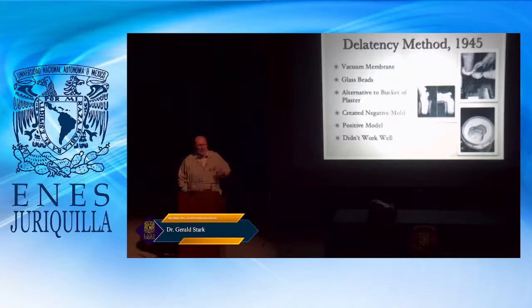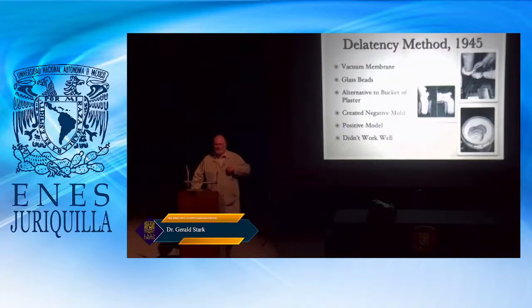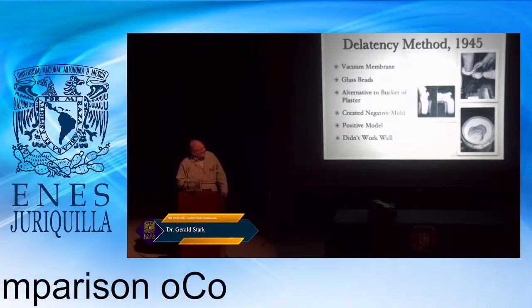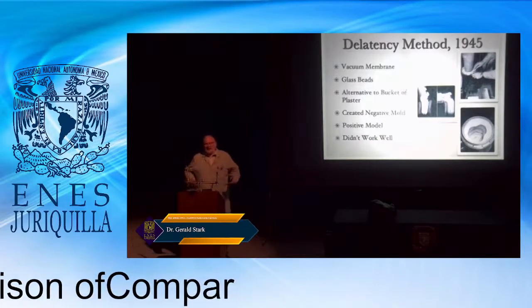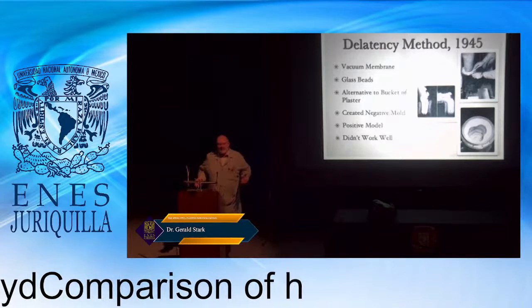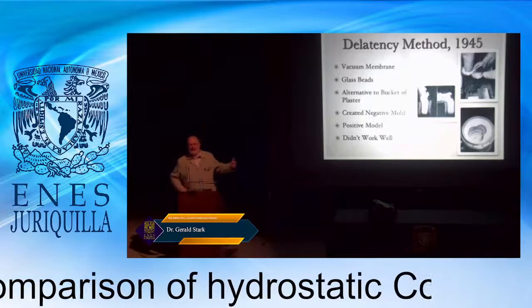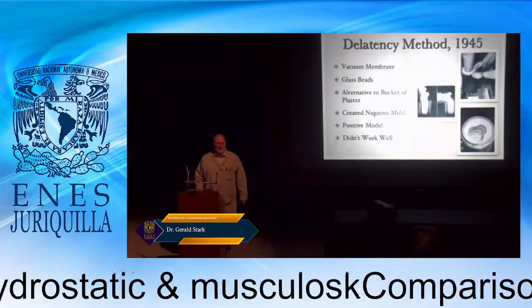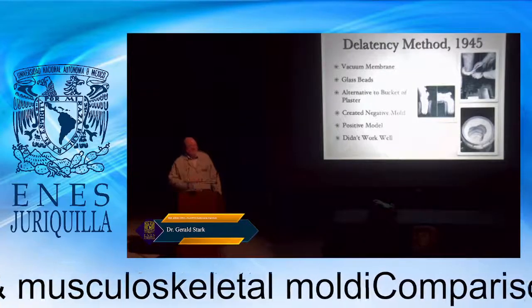And Dr. Wu, one of my mentors at Chicago, has talked about the sand casting technique, where you use sand to find the position. This is a great way to capture the limb fast, but what would be the downside? The downside is you're really not compressing the tissue at all. In fact, you're really just compressing the space outside of the limb.